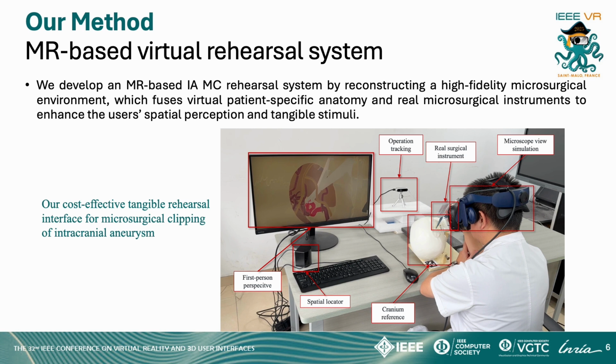The picture shows our MR-based virtual rehearsal system. We developed the system by reconstructing a high-fidelity microsurgical environment, which fuses virtual patient-specific anatomy and real microsurgical instruments to enhance the user's spatial perception and tangible stimuli.